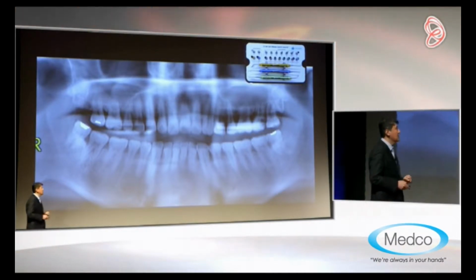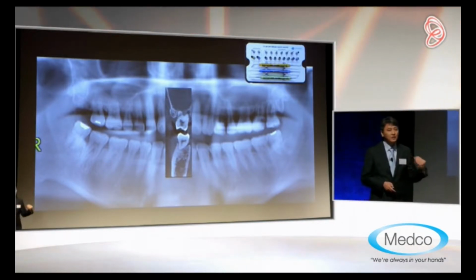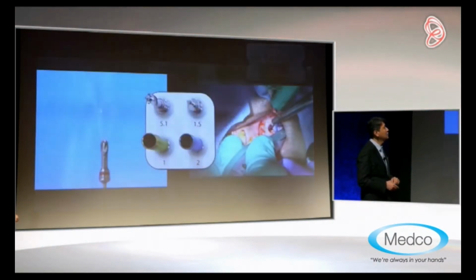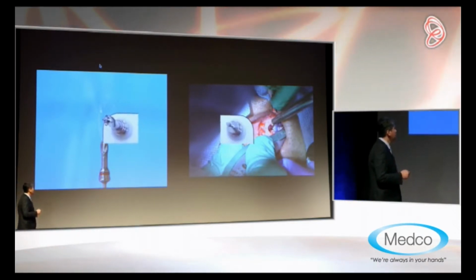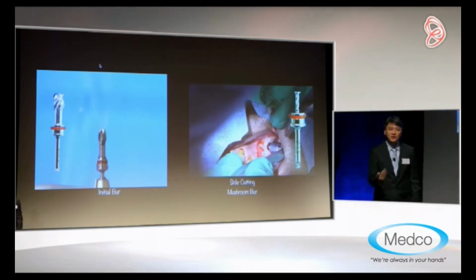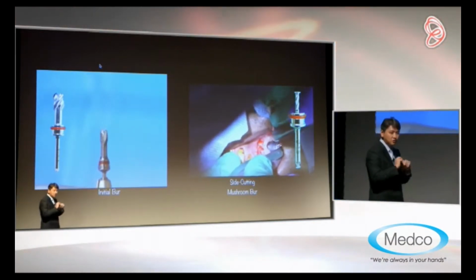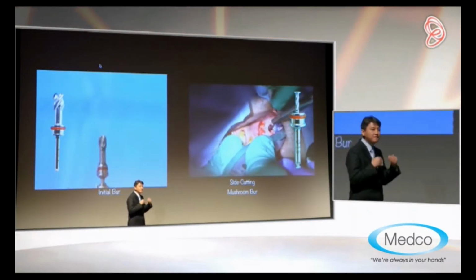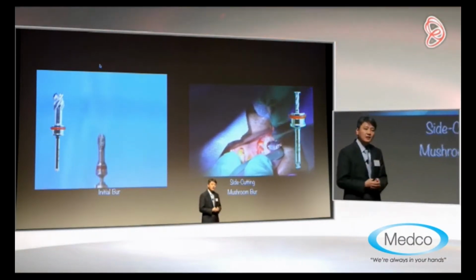So as you can see, this patient came in with severe periodontal and decay. We extracted and we elected to do lateral window technique. And I just want to show you quickly how to do lateral window technique. We have a special burr where the water shoots out as we are drilling. So when we penetrate the sinus floor, as soon as we are penetrating, the water is scoring and protecting the Schneiderian membrane. This is the safest and the fastest way to open sinus without rupturing the membrane.